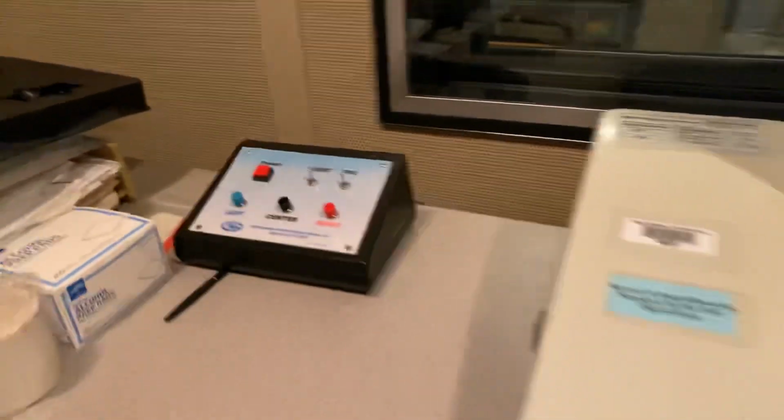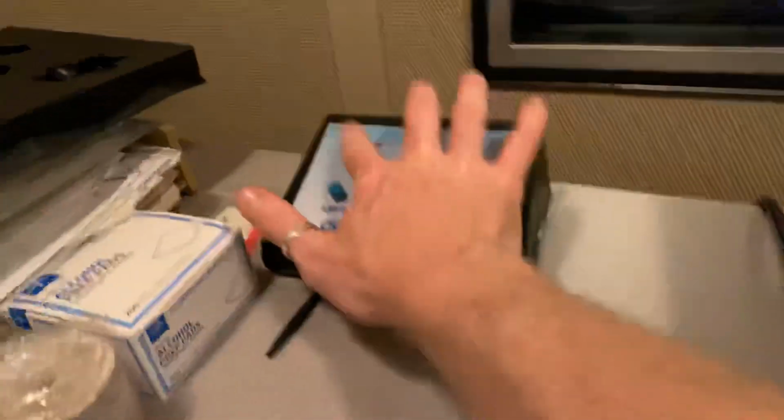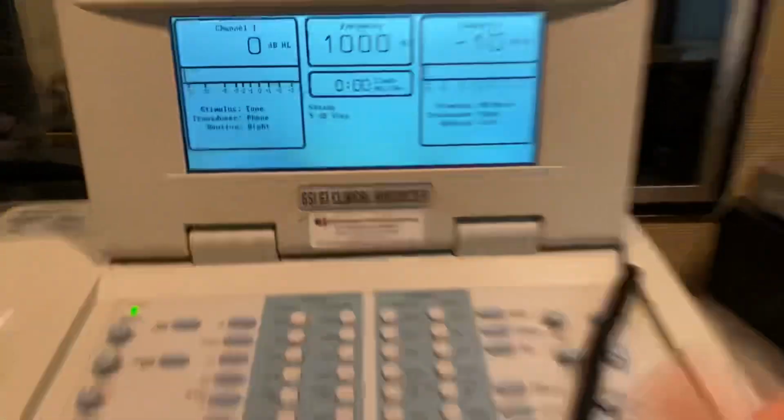Now, there are 2 pediatric tests that I want to go over really quickly with you. I'm going to set this up. I'm going to turn it around. With little kids, we obviously cannot do standard audiometry where we have the child raise their hand when they hear the sound. They just can't do it. An infant can't do that, obviously.